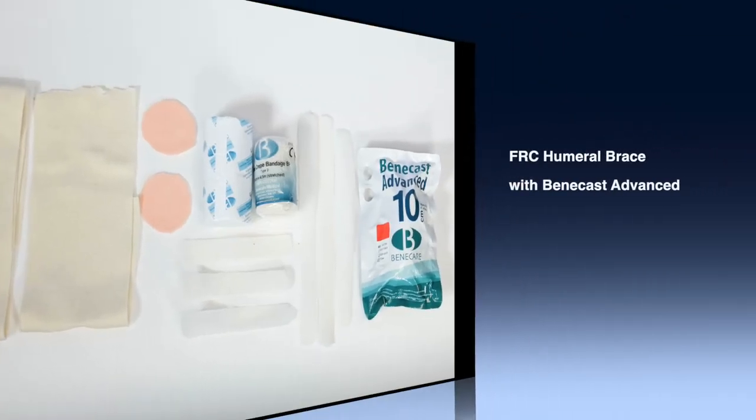Today I will be demonstrating the application of a humeral brace with Benecast Advanced using a focused rigidity technique.